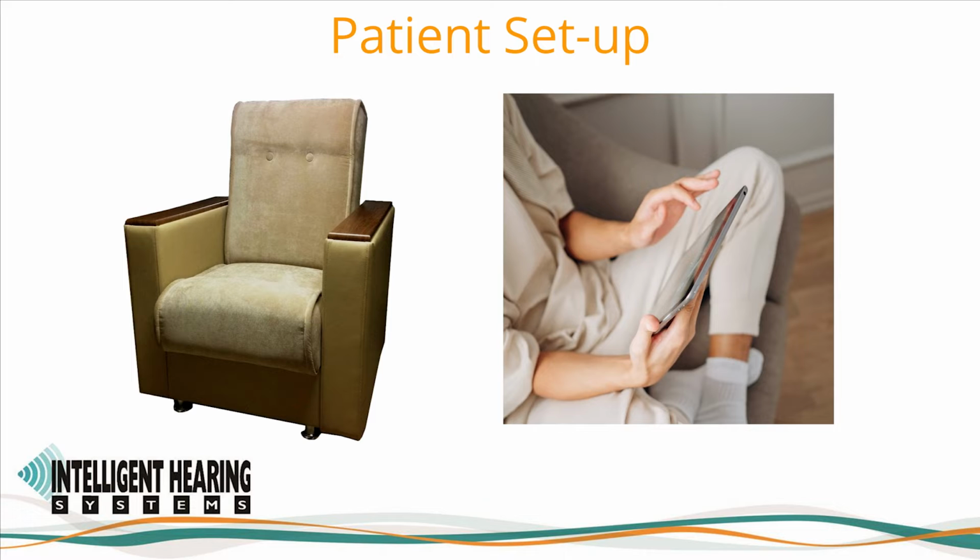If connected to power, tablets require a 3-prong grounded power supply. If the tablet does not have a 3-prong grounded power supply, then it should be fully charged and run off of battery in order not to introduce any electromagnetic interference.